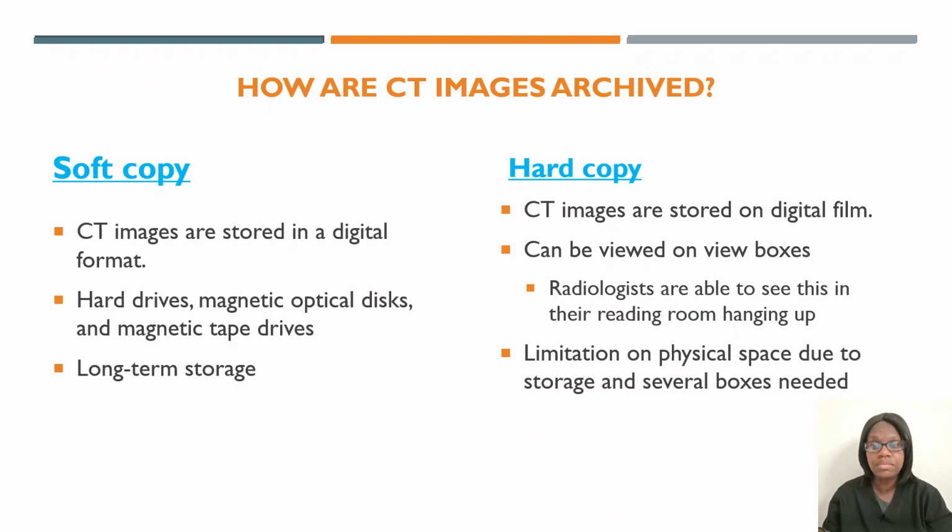So you will see it hanging up and the light to the view box will be on so the radiologist can see it. They don't look at the image in their hand with their room light on. The room light stays off and they read the images by hanging them on that view box. So you do have a limitation on physical space due to storage and several boxes needed.